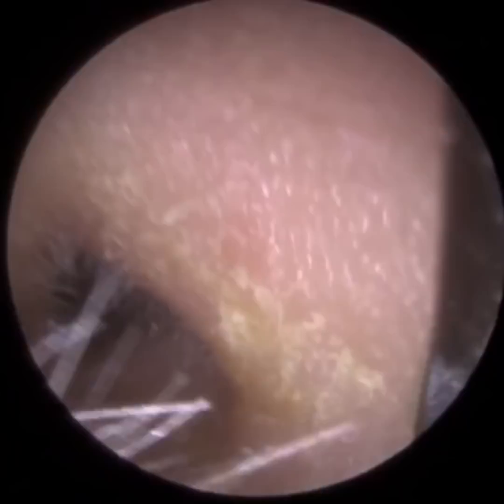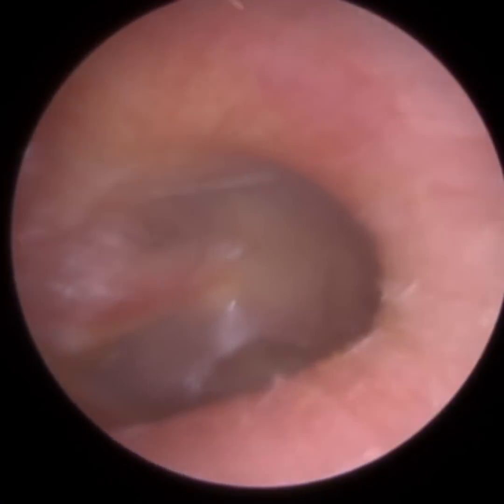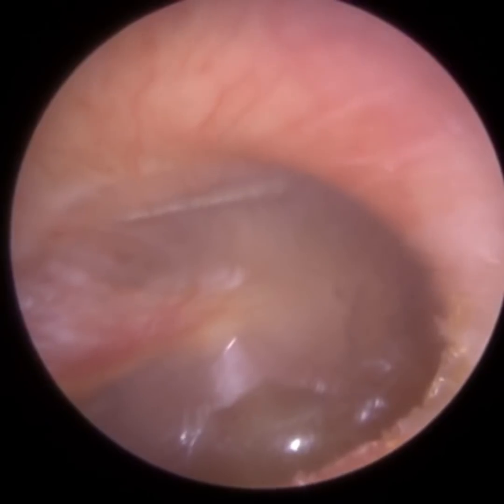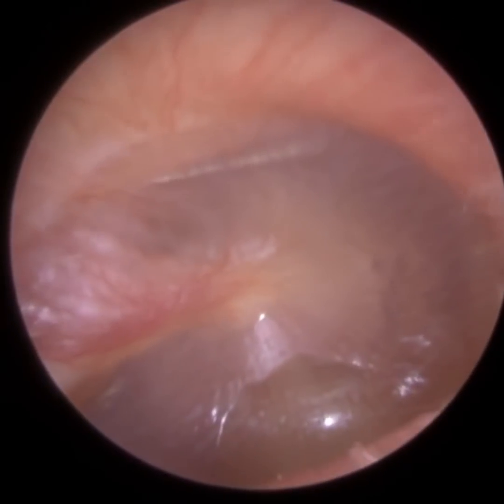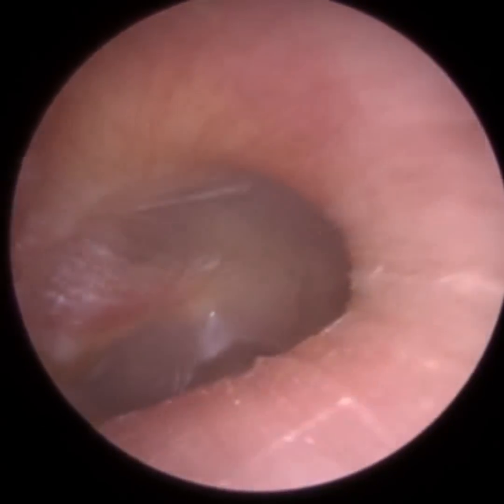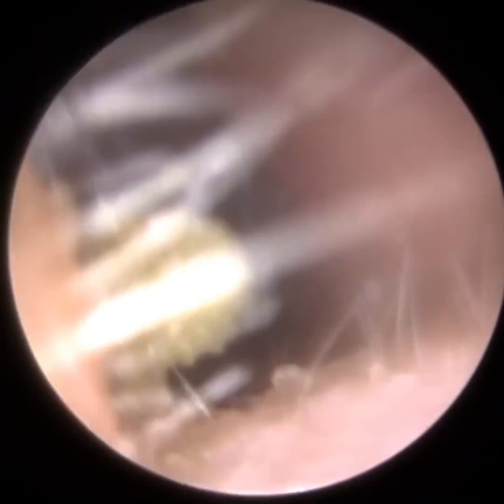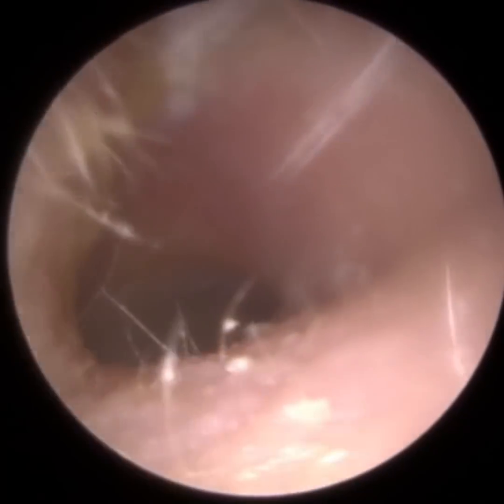So I think they've been forcing air up the eustachian tube, and you'll see the bottom left is a bulge, the eardrum bulges out. They just had a bit of excessive air pressure trapped in their middle ear, so the eustachian tube probably is a bit blocked, and they managed to force air up the eustachian tube, and the eustachian tube then blocked itself, so it's unable to equalise.